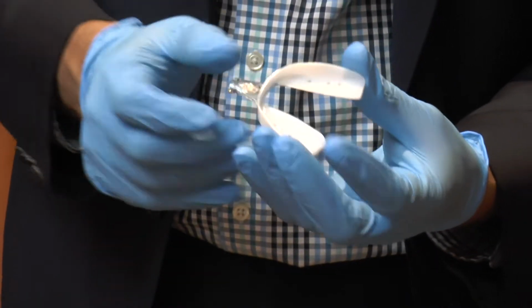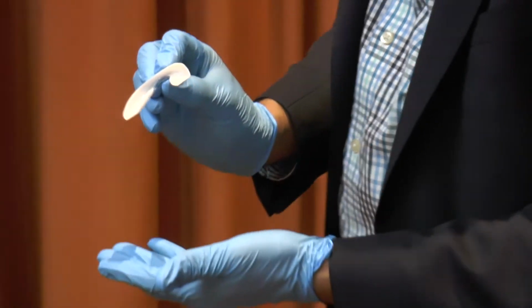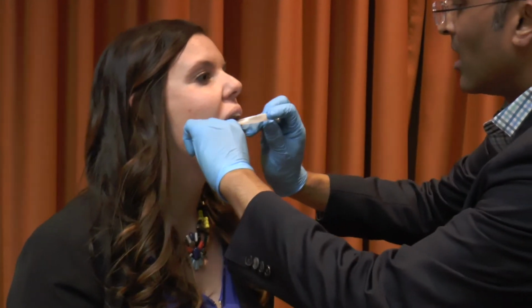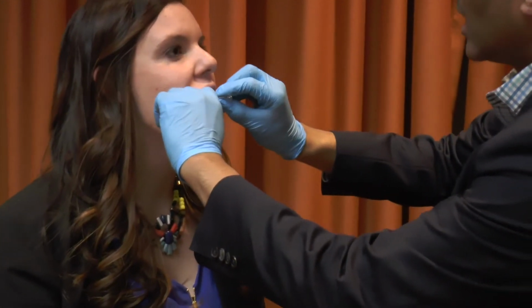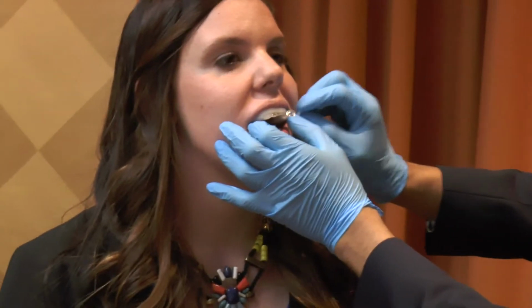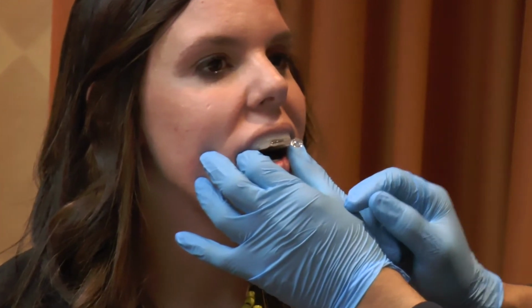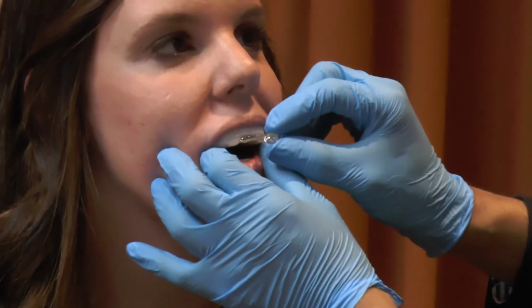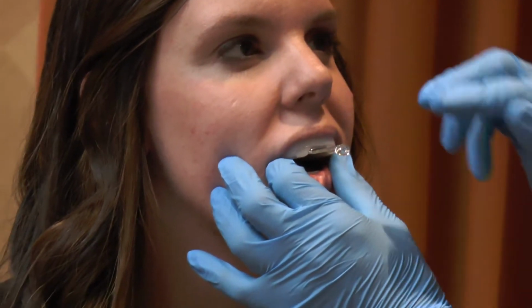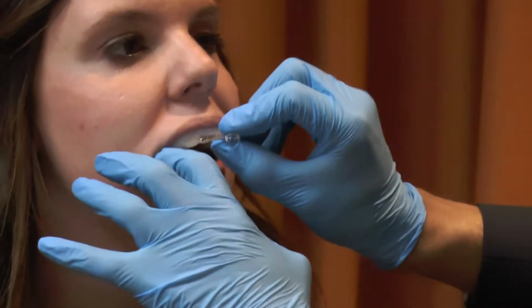So what we're going to do right now is just see if this is the appropriate size for our model. We're going to take a look at the device, and we're just going to passively align it over her upper teeth. What you're going to notice here is when I set this in, I take this beak and use the tip of her nose as a point of reference. The idea for that is when we get this device in the mouth and molded to her teeth, we line it up with the nose so that when we do the lower arch, we have the same point of reference.